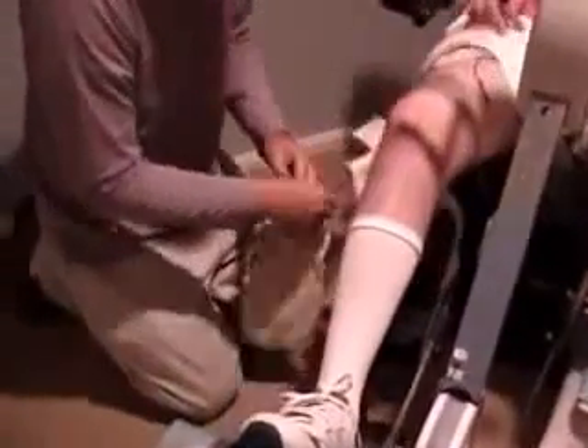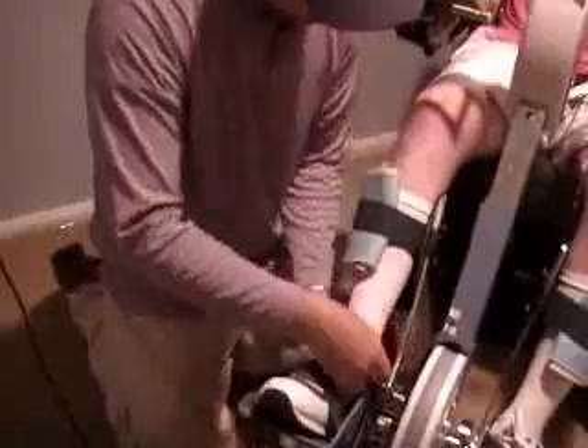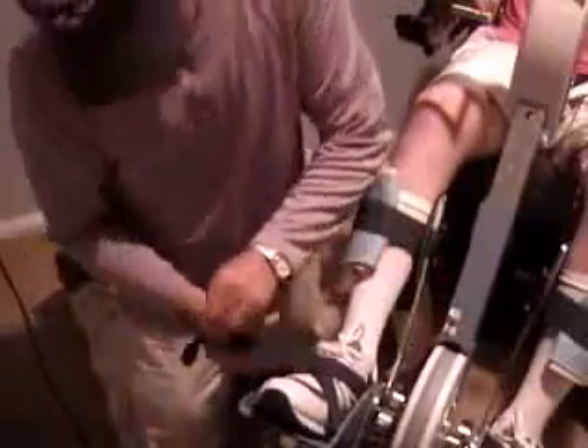Before getting on the bike, you do want to put the electrodes on your butt muscles, which is called your glutes. That is best done in bed, but you can do it in the chair — it just takes some skills.